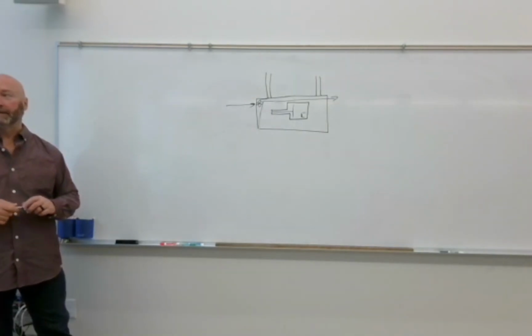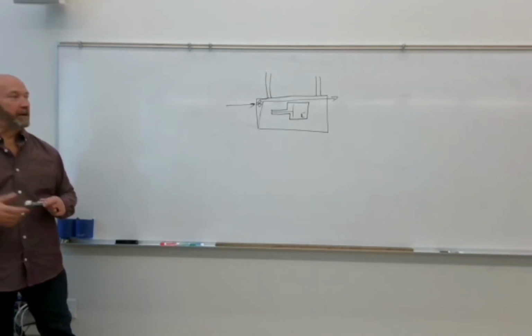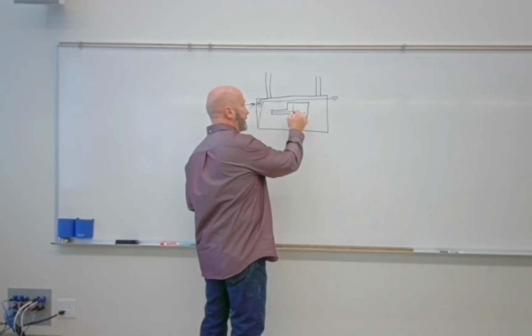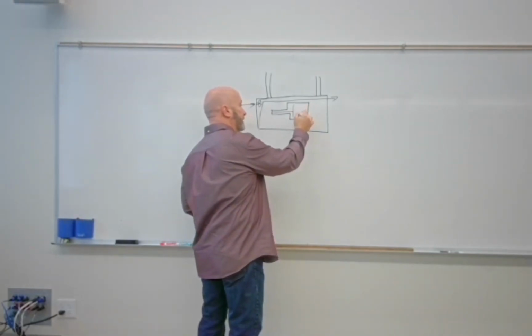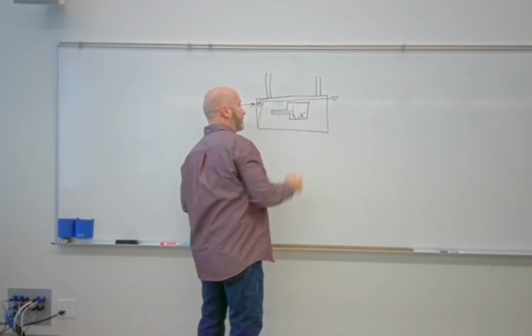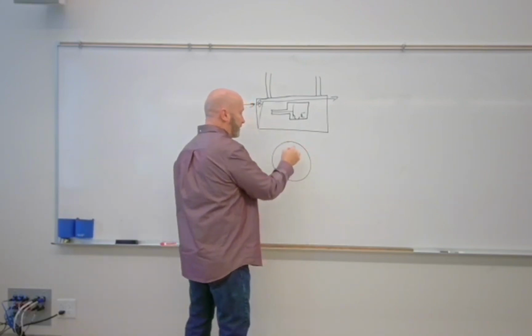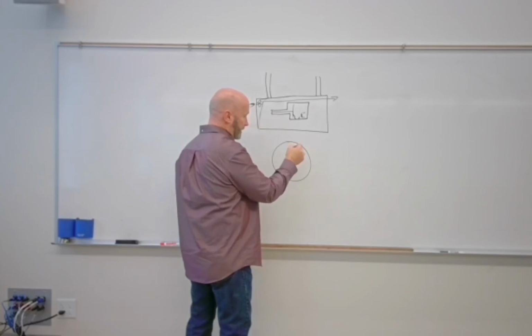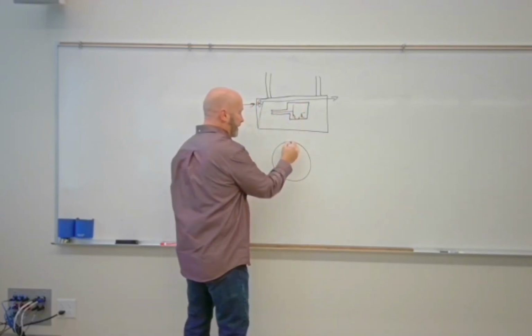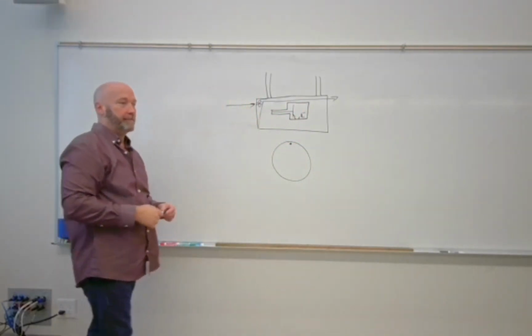I said one just a second ago. Thermal radiation. Right. So thermal radiation, the first place we're going to see thermal radiation is that we have the heat here, and we're going to get thermal radiation off of it. We deposit the heat here, and we're going to have thermal radiation off of that as well. But also, our area of bombardment on the anode, so now we've turned this so that we're looking straight at it. The area of bombardment is going to be very small, a little bitty area, measured in millimeters.